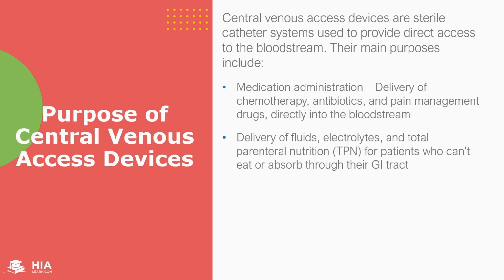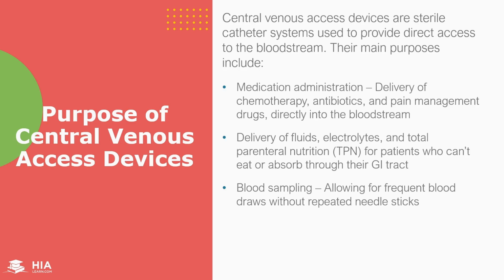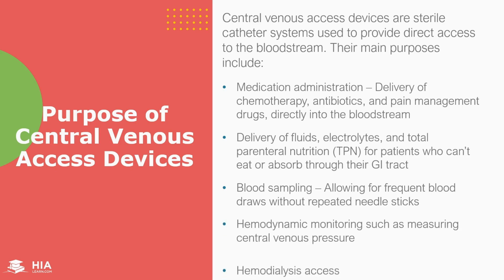Central venous access catheters also allow direct access to blood for blood sampling that does not require repeated needle sticks, hemodynamic monitoring such as measuring central venous pressure, and access for hemodialysis.